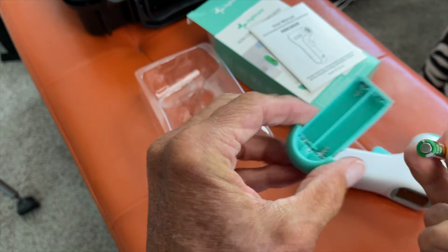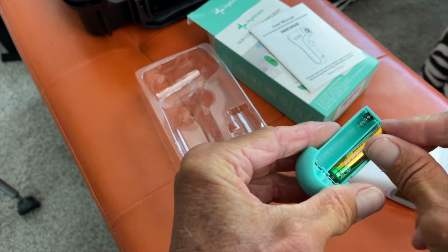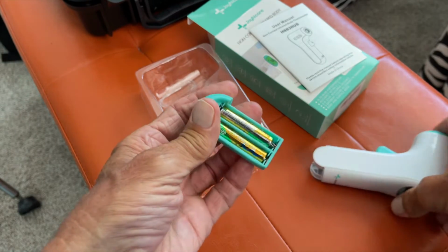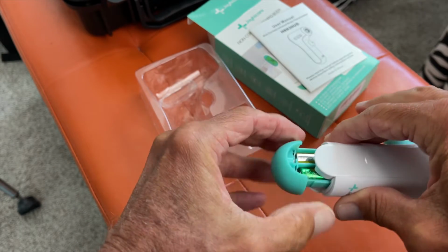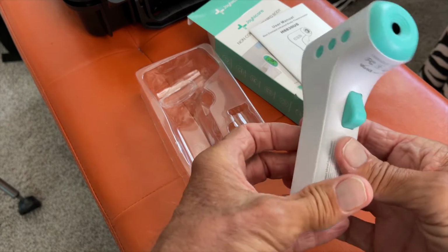So usually your negative side goes with your spring, and I do believe that's correct. So you want to put in negative side with the spring, and bam, there we are. We're done. Right now, we just got to shove her back in there. Just remember the way when you pulled it out, which way it was, okay? All right, it's in, ready to go.